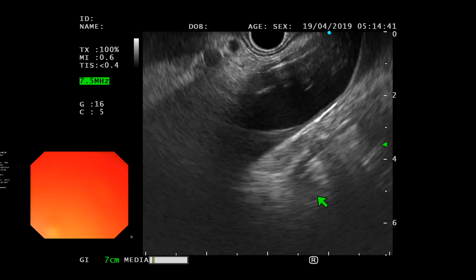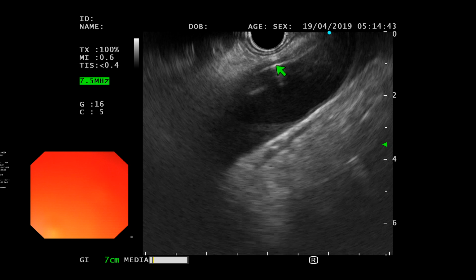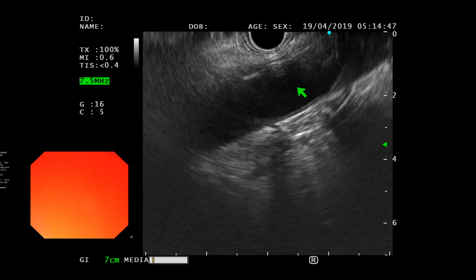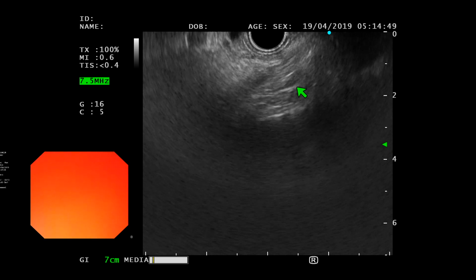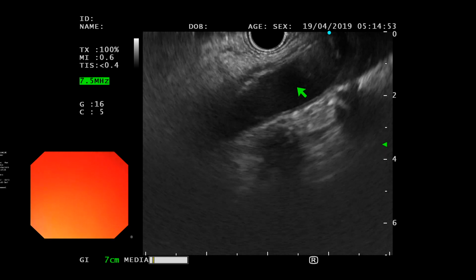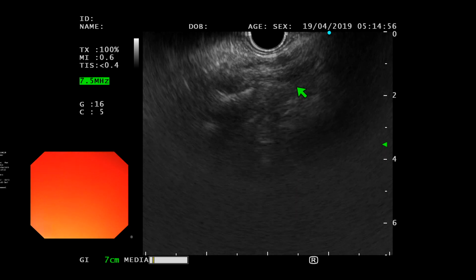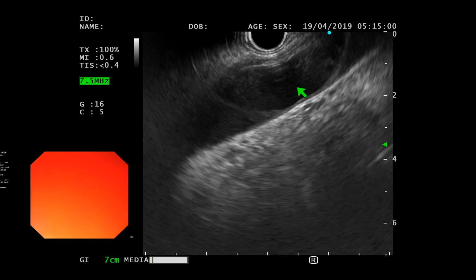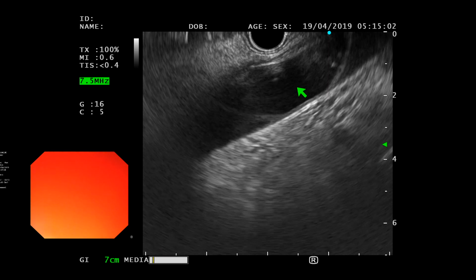So you've got the diaphragm there, and you've got the celiac, and you've got the SMA. Happy with that now? Now your brain has learned this, your fingertips' intelligence will now tell you what maneuver, so slightly left, and you will see that time. So you've already seen this three times without your brain, and this is the barrier I wanted to break. You with me?